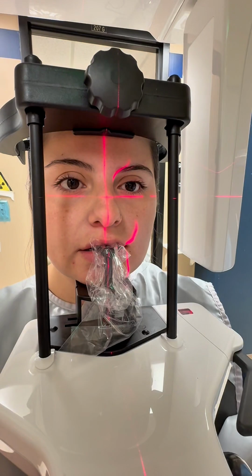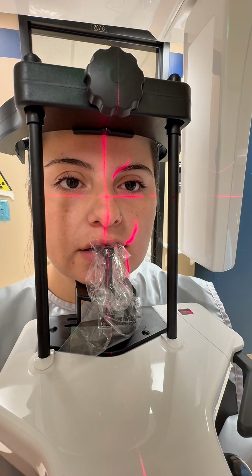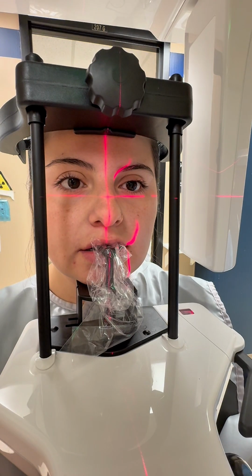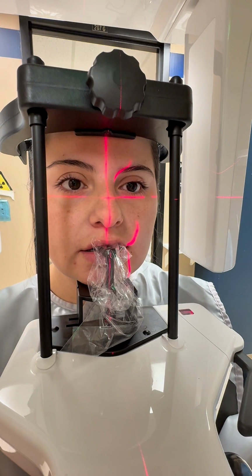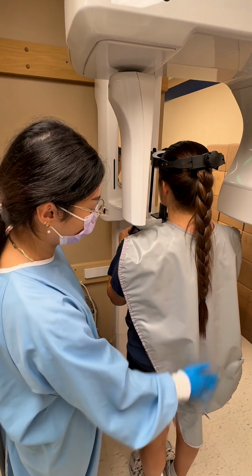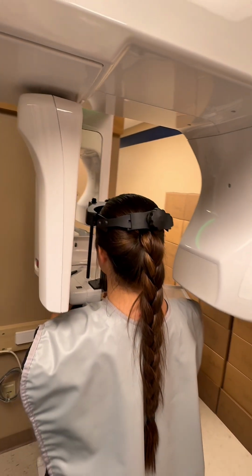Adjust the head to allow the Frankfurt plane light to pass through the floor of the eye orbit, and the external auditory meatus is parallel to the floor. You will also want to adjust the head to the left or right so that the mid-sagittal plane light is aligned correctly in the middle of the nose. Check the patient's spine and occlusal plane, then make any final corrections to the patient's position.